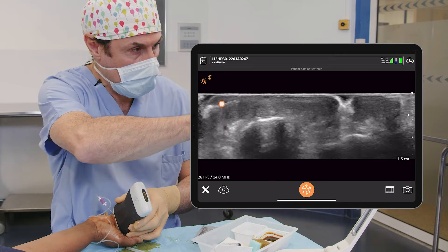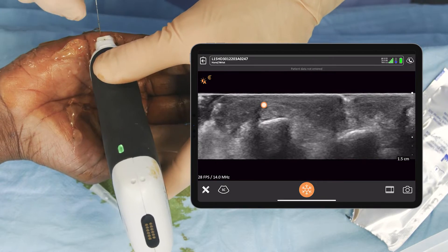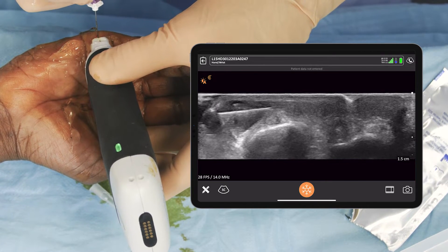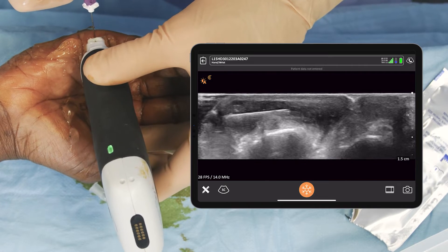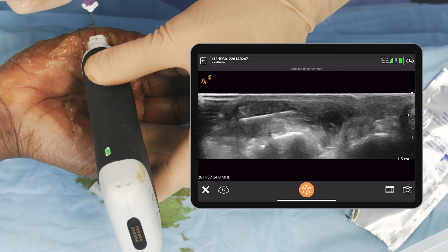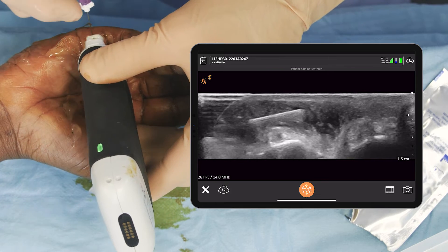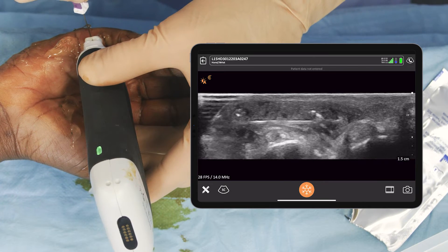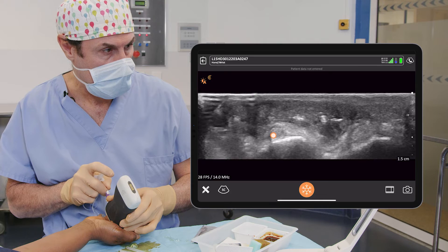We see here the needle on the right side of the screen, the tendon. So we begin with anesthesia and then injecting all around the tendon. It's lidocaine one percent with adrenaline and some sodium bicarbonate. We are near the nerve here on the right side of the tendon.